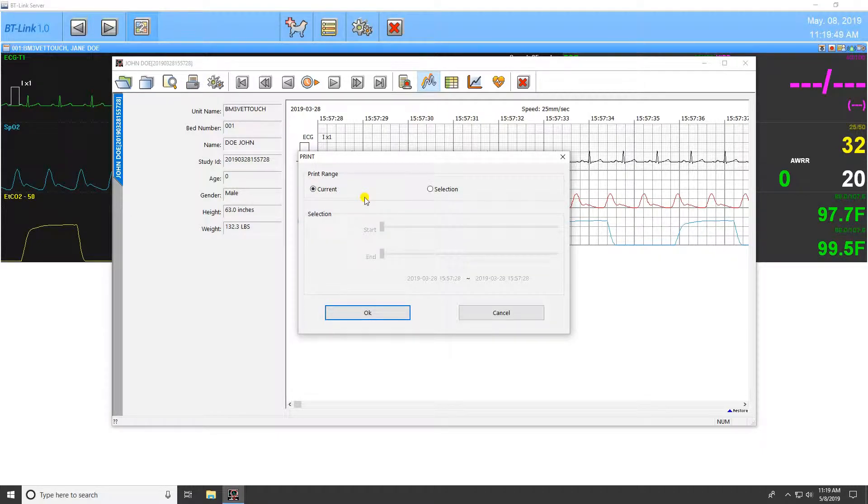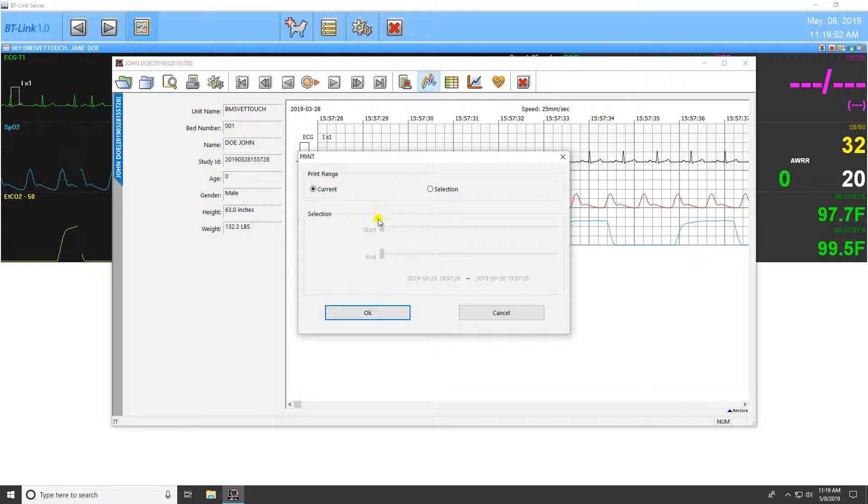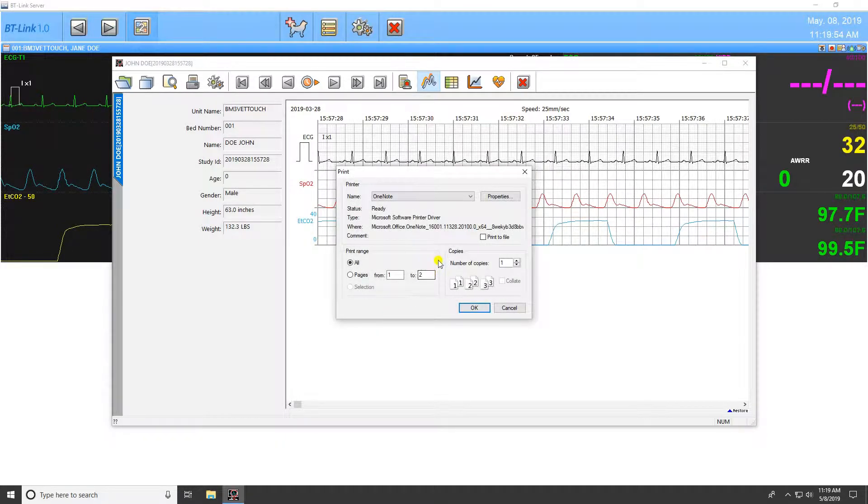Once print is selected, you will be given the option of printing the current study or just a selection of it. After hitting OK, the print screen will display.